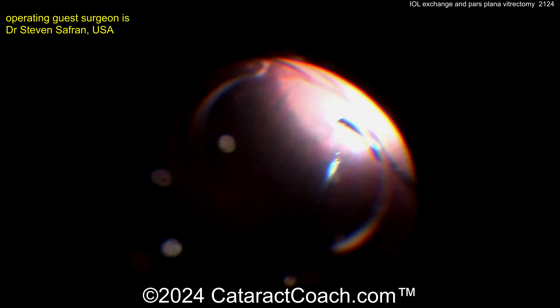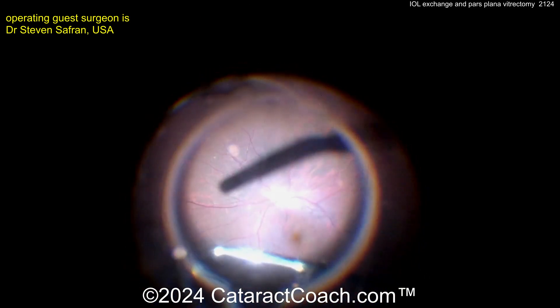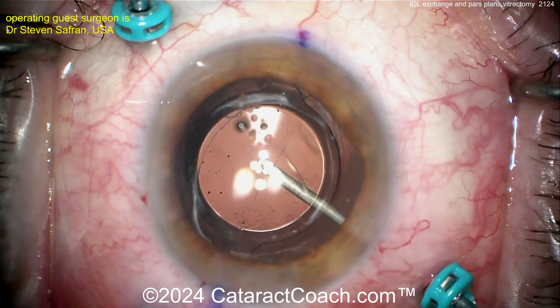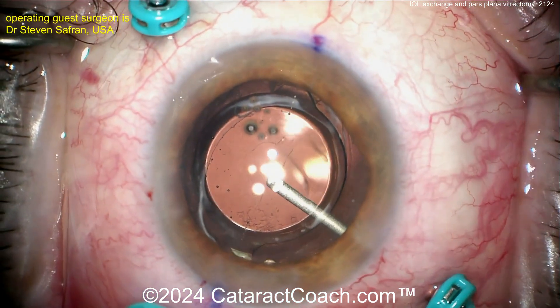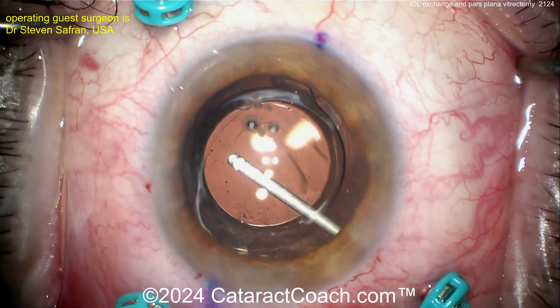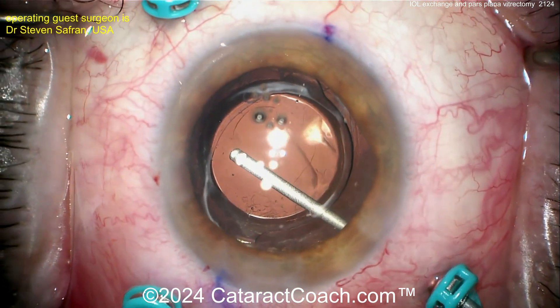So cleaning all that out is going to give the patient some really nice vision — a good, complete cleanup here. Make sure you check all the periphery, make sure the retina looks good, and check for entry site breaks when you're done. Now look at this — the vitrector is now being used to open up the posterior capsule, so you don't have to worry about doing a YAG capsulotomy later. A nice controlled opening of the posterior capsule just to have a clean visual axis and never worry about a future YAG laser capsulotomy.